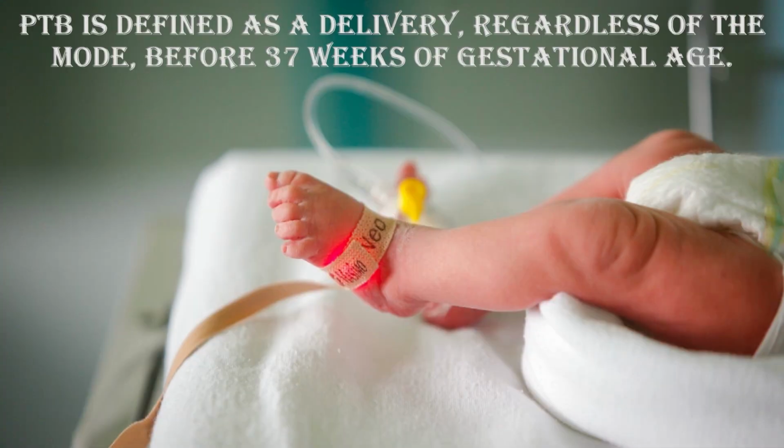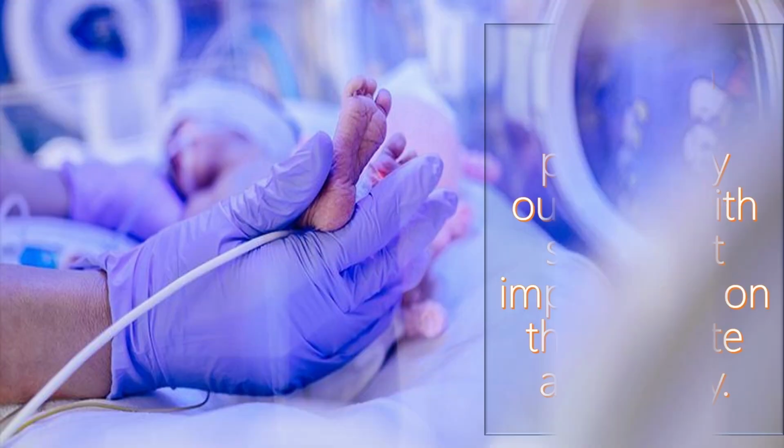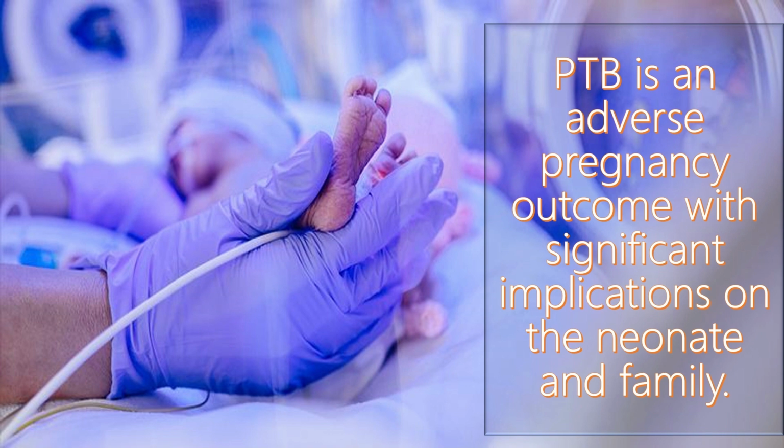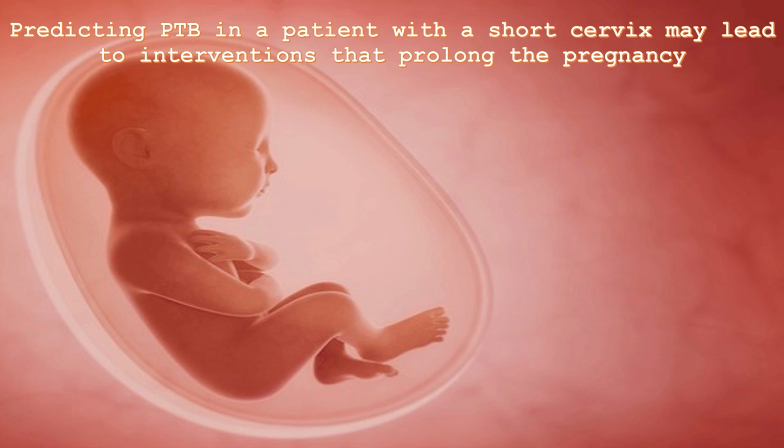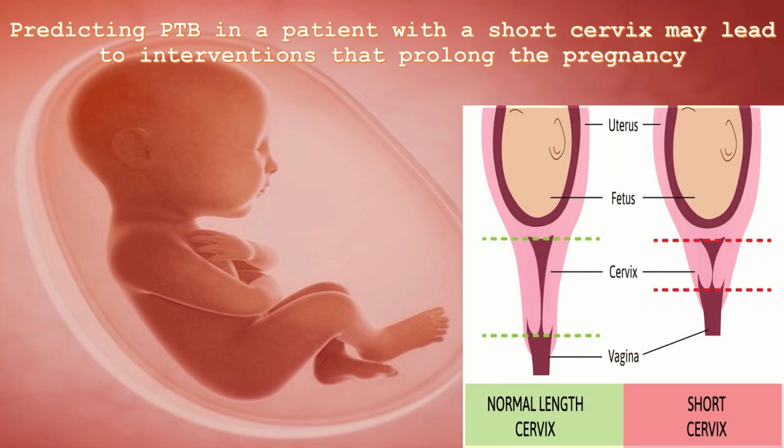Preterm birth is defined as the delivery, regardless of the mode, before 37 weeks of gestation. Preterm birth is an adverse pregnancy outcome with significant implication on the neonate and family. Predicting preterm birth in patients with a short cervix may lead to interventions that prolong the pregnancy to optimize outcome, even allowing pregnancy to reach full term.